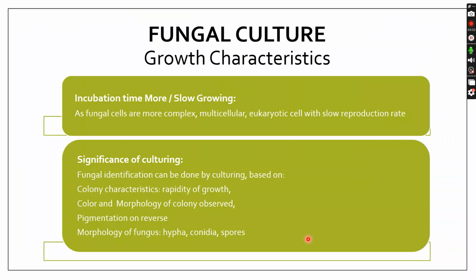After staining, there is another method for the diagnosis, that is the culture. For culture media, there are certain growth characteristics of fungus. As the fungus is a eukaryotic cell, it will take more time to grow. It is a slow growing organism. So why is it slow growing?